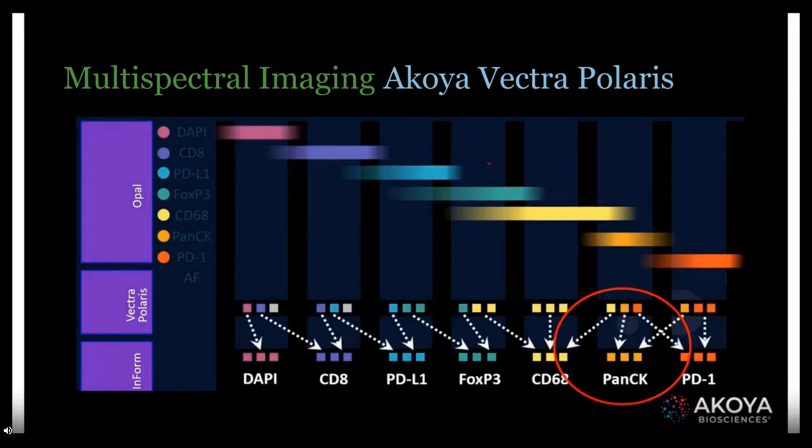And so the software here will estimate how much of the signal belongs to each of those 3 markers and bin them together, not in a per scan channel fashion, but per marker instead. So then you'll end up with a computed channel that is enriched for your marker. It's also used to remove autofluorescence from the background signal.